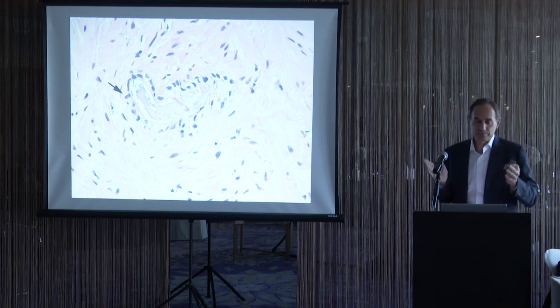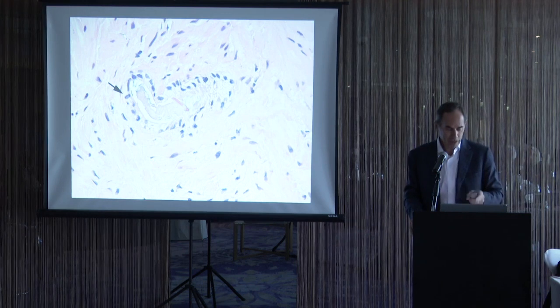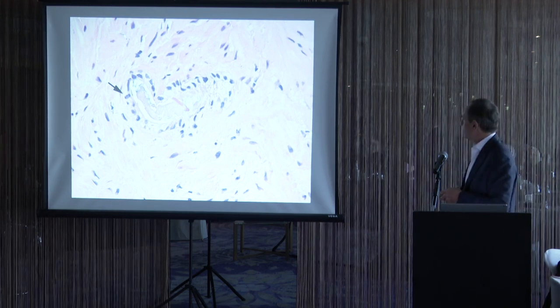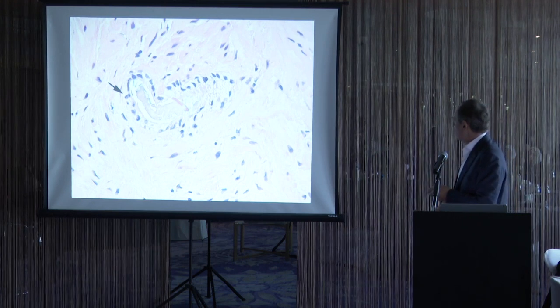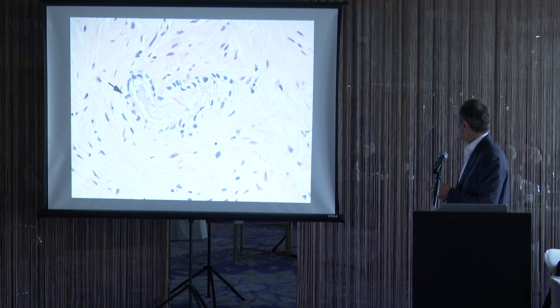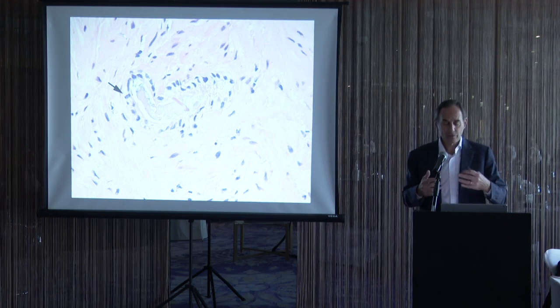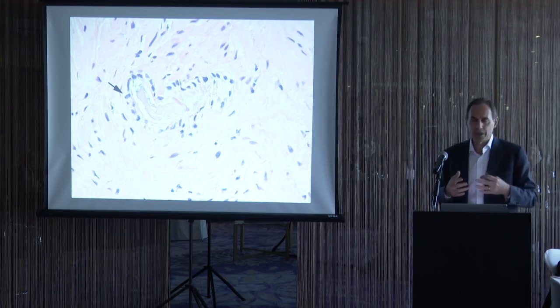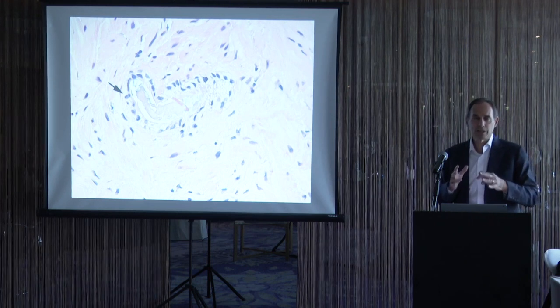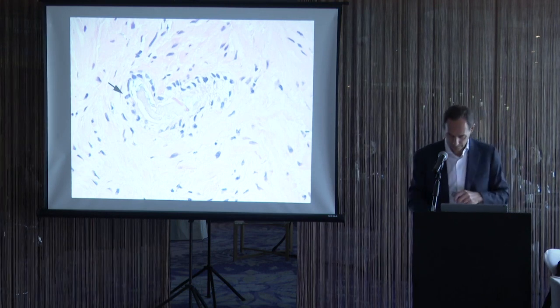As a pathologist, we're not allowed to make a single mistake, especially in terms of overdiagnosis. But in this case here, we had a single atypical gland. There was a benign gland on the top and on the bottom. And we had a mitotic figure, crystalloid, dense pink secretion, bluish mucinous, hyperchromatic nuclei, multiple features favoring cancer. So when you have often just a few atypical glands, in order to feel comfortable diagnosing cancer, you often need multiple of these atypical features that would be impossible in a benign gland.